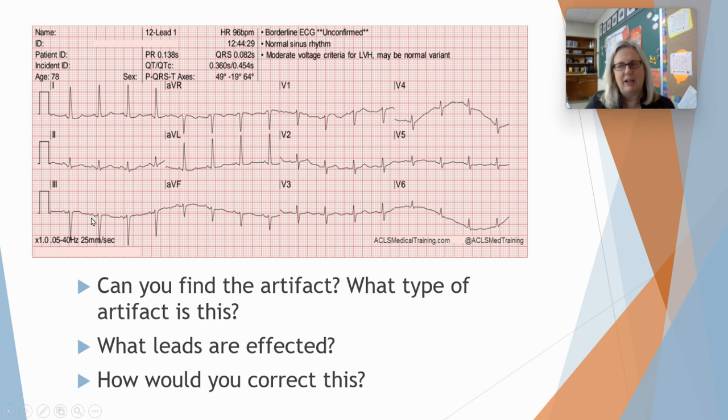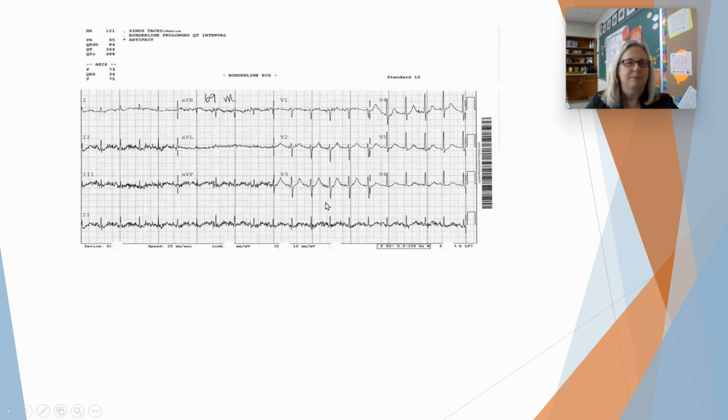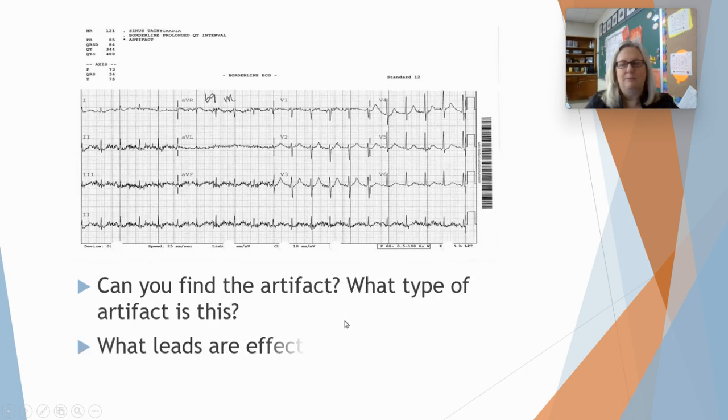Okay, a little bit over here too. It might correct it once you move V4 to V6, but definitely too close to the diaphragm, or maybe they just tried to do it too quick. Okay, simple. All right, how about this one?